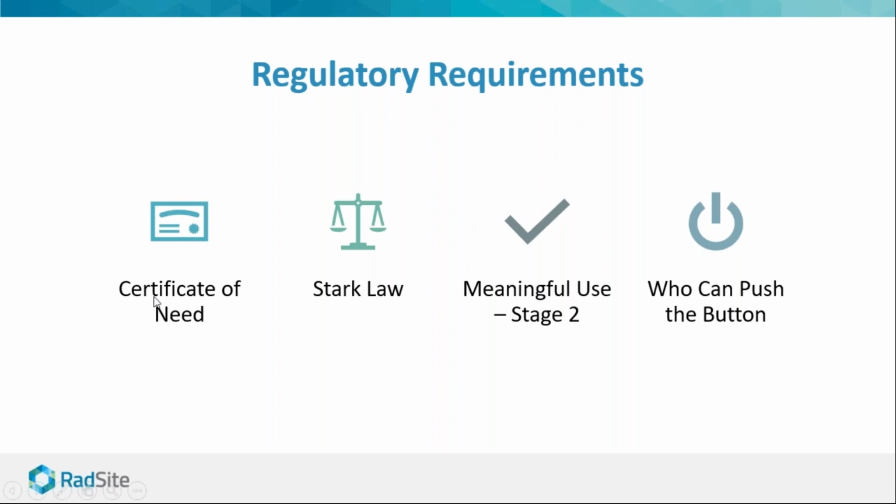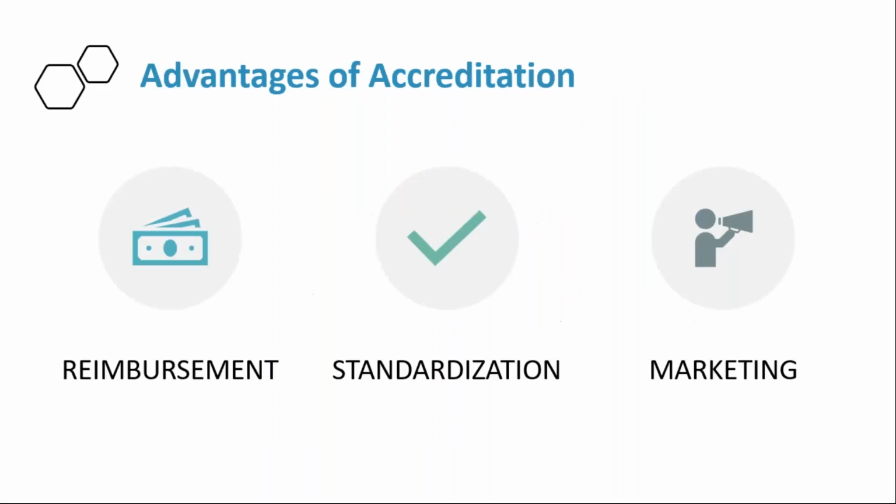A lot of other small requirements, even things like your radiation signs, your radiation safety training, dosimeter badges, your backup of CT scans. All states have a specific, or many states have a specific registration form, or even physicist survey testing. And of course, we help you wade through all of these, but these are just things to consider. So when you're looking at a CT scanner for your office, you'll want to ask, what are the regulatory requirements, and make sure you're on top of all of those.